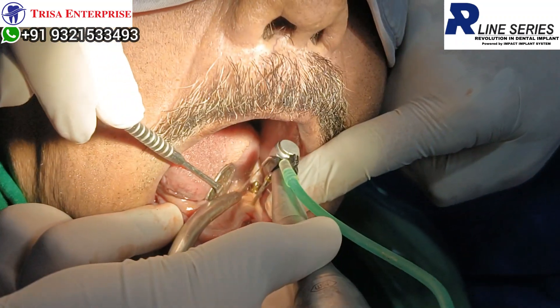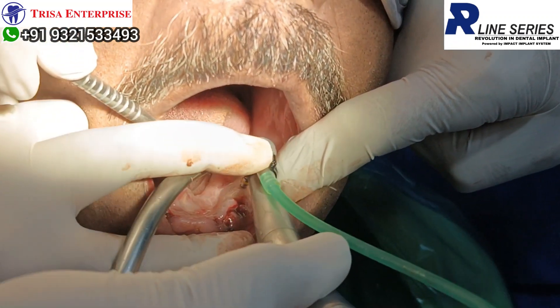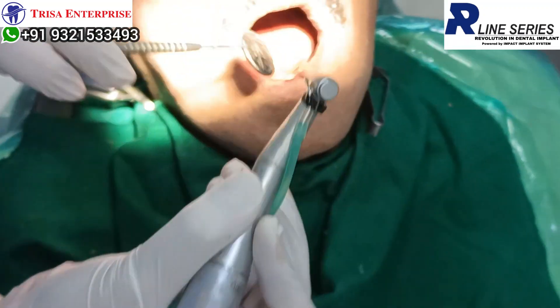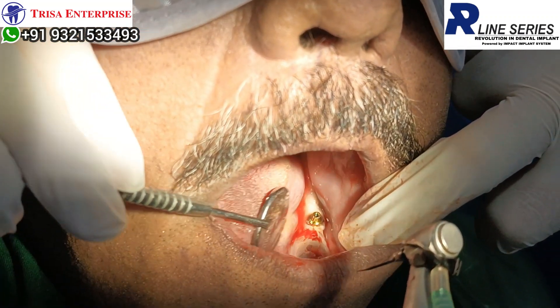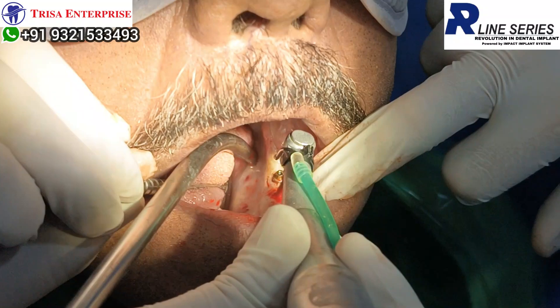Are you ready? Keep it gentle. So mine is not going in the book — correct? Let's take off. I'll take the manual section there.